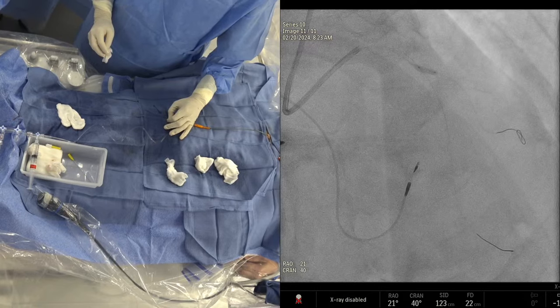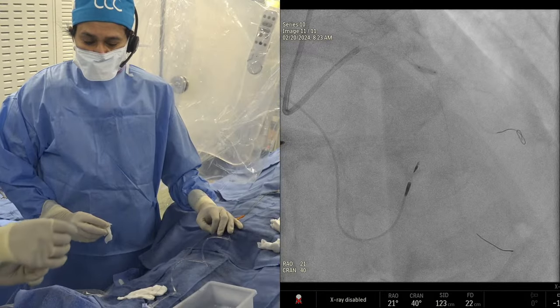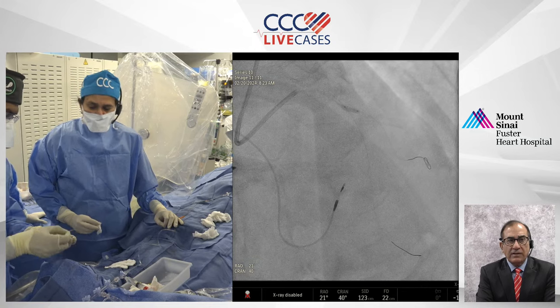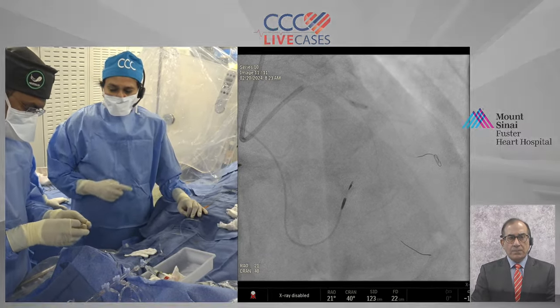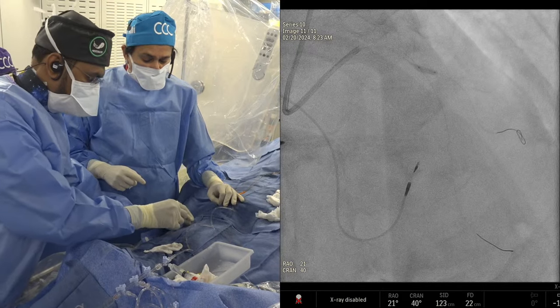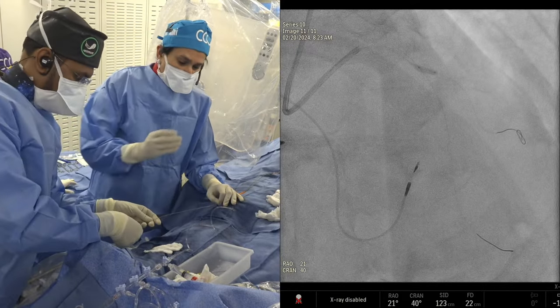So just do the first. This one we do step crush. Anu, why do you have a hesitation about putting the third wire there? It just makes the procedure more complicated, more technical, with three wires intertwining, thrombus formation. Exactly. The balloons are coming in and out, everything gets complicated. So I would say step by step.